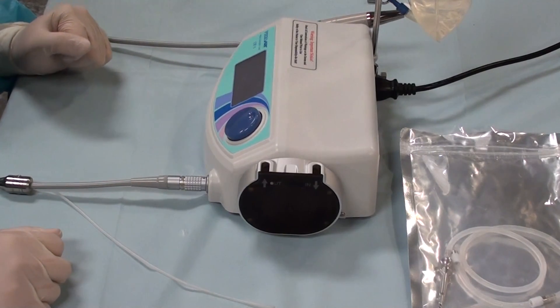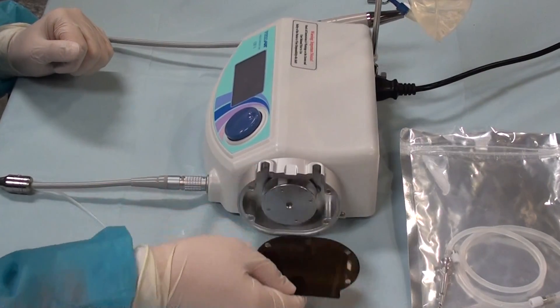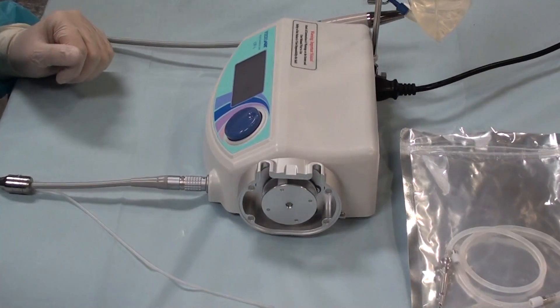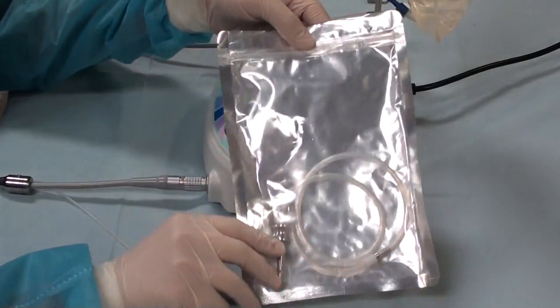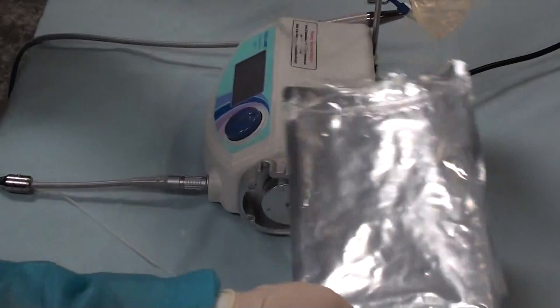We're going to be installing the auto-clavable tubing into the new pump housing unit. Start off by taking off the magnetic cover and setting it aside. Then get your bag with your auto-clavable tubing, open it up, and remove the contents.